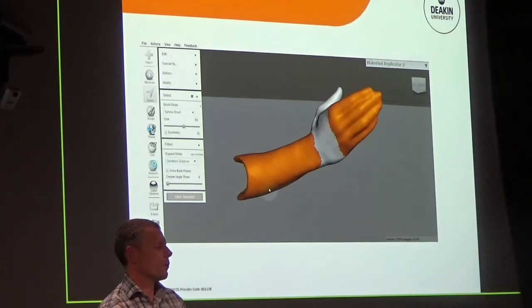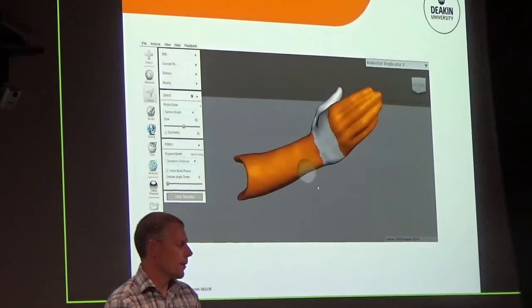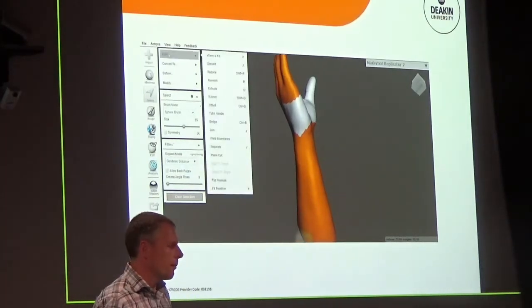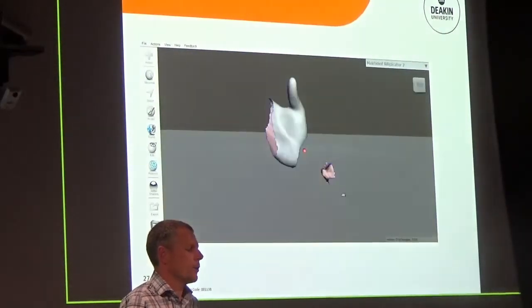It's very much the clinical reasoning that you would be demonstrating on a standard today. We don't want it to impinge the wrist, and just get rid of all the extra little bits that hopefully are going to disappear in a sec. And with that, modify, discard that section, and we're starting to create a splint already.